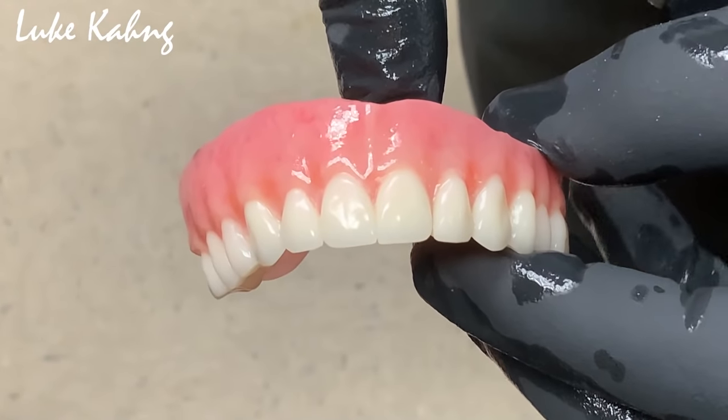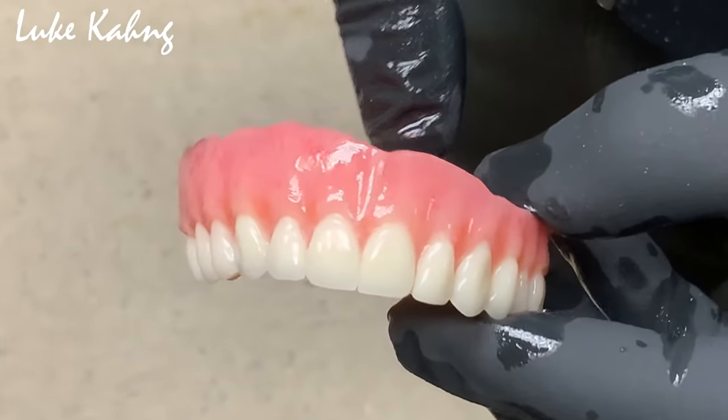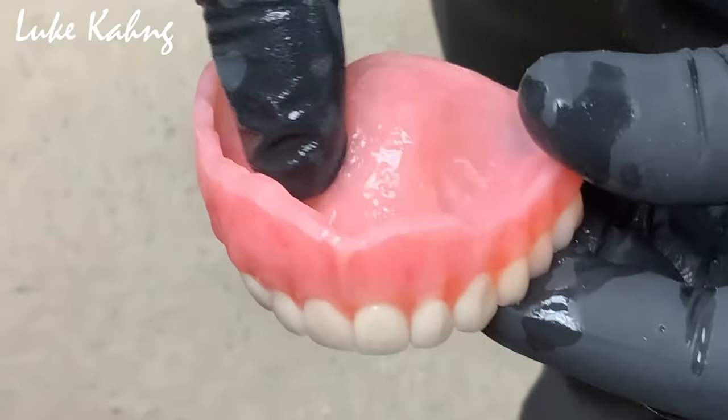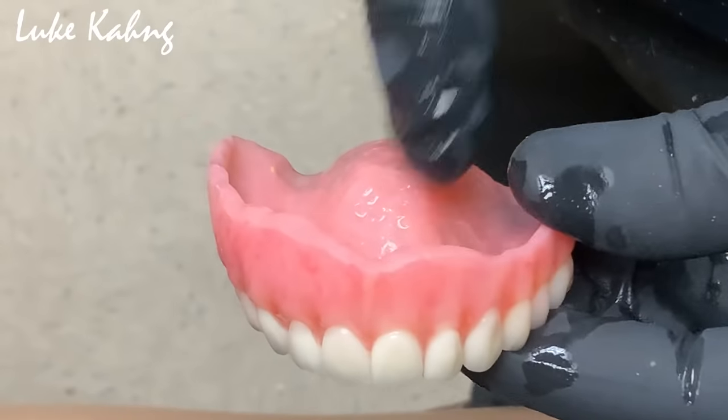So just remember that. Some patients will say, oh, can I just use glue? I said, no. No, never. That's not supposed to be for a new denture. And if they get to the point where it starts to get loose, then you have to go into the dentist and get a reline. Okay, there's a video on a reline that you have. Okay. Yeah. Just try.